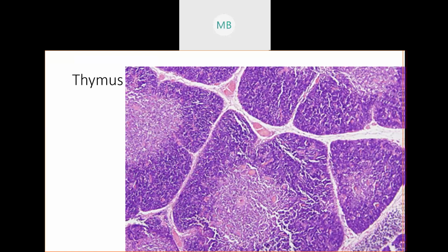So your thymus here is divided into lobes, just like streets and buildings for a dormitory, because remember, your white blood cells are going to be growing up big and strong in your thymus so they can do your immune system's job. So this right here, like you can see this septum here. So you have this chunk or lobe here. You can see another lobe here.